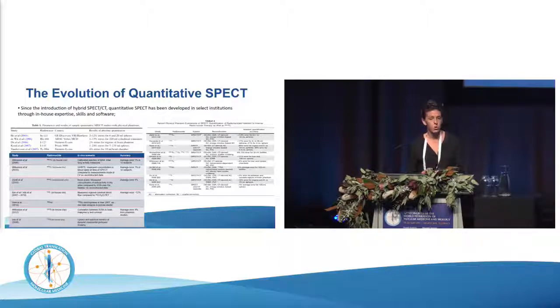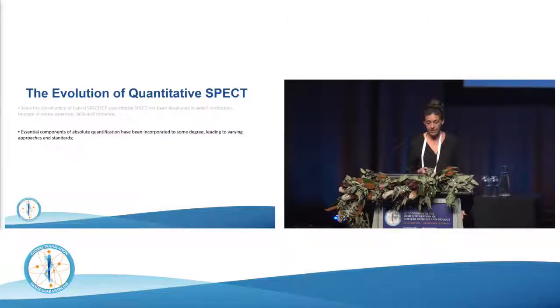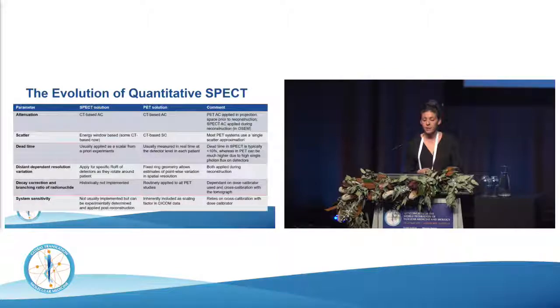But certainly we do know that that breaks down for the smaller volumes, particularly given the inferior spatial resolution of the SPECT system over the PET system. So partial volume effects are certainly something that have been an issue for SPECT quantification and certainly still are. In terms of what is required for quantitative SPECT data, I guess very similar to what's necessary in PET as well. Attenuation correction certainly is an absolute must.